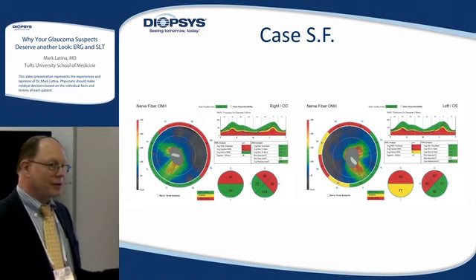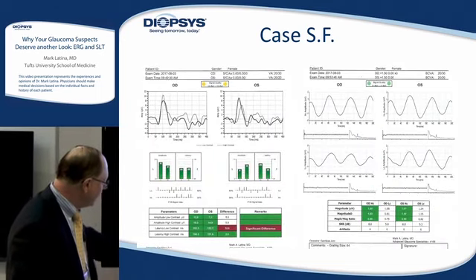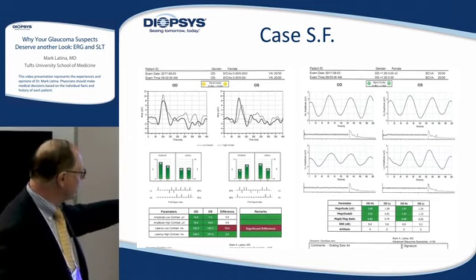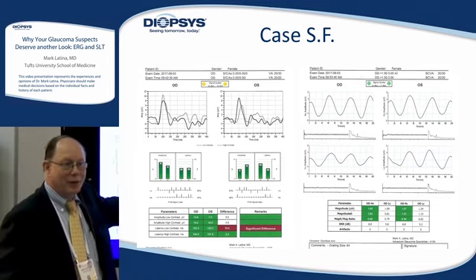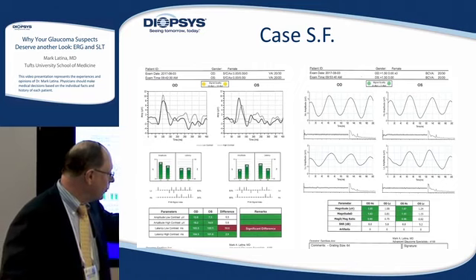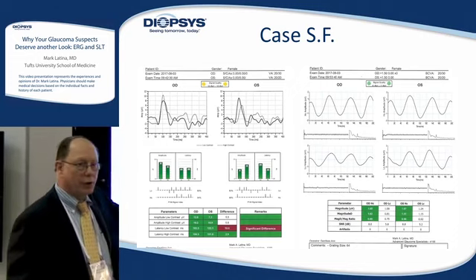So, of course, I think this is a great role for a pattern electroretinogram and VEP. We did the VEP, basically normal. There was slight difference in the low contrast, but really not that significant. And I think most importantly, here's the pattern electroretinogram. It's completely normal. The signal strength is good. She's got actually very good magnitudes, 1.8, 1.6. We'd like to see about 1.2 microvolts or greater as being normal, so she's totally normal.